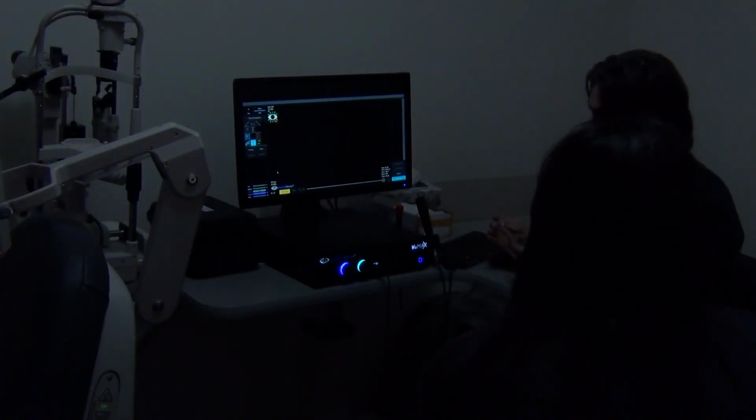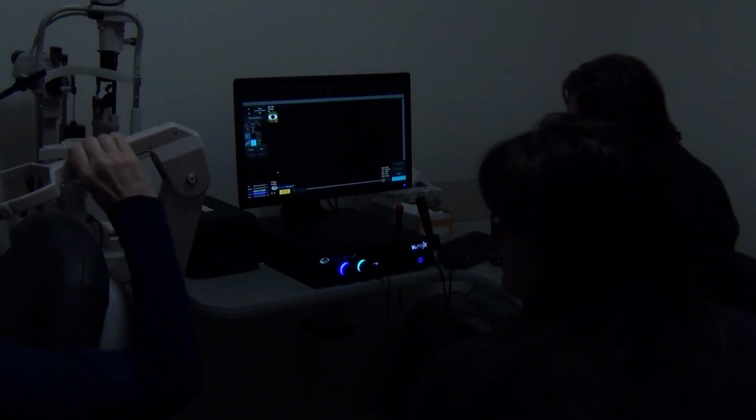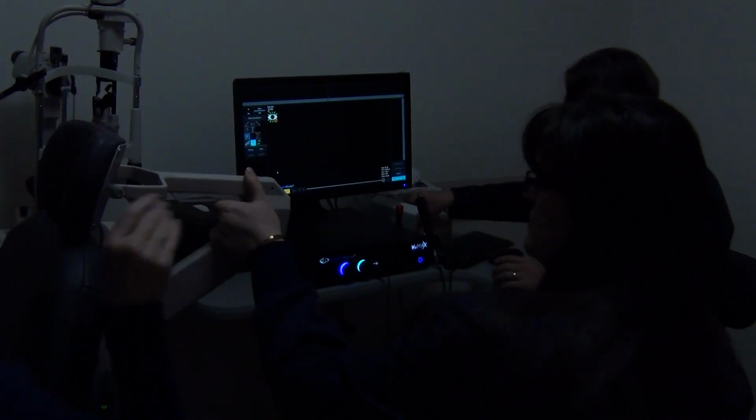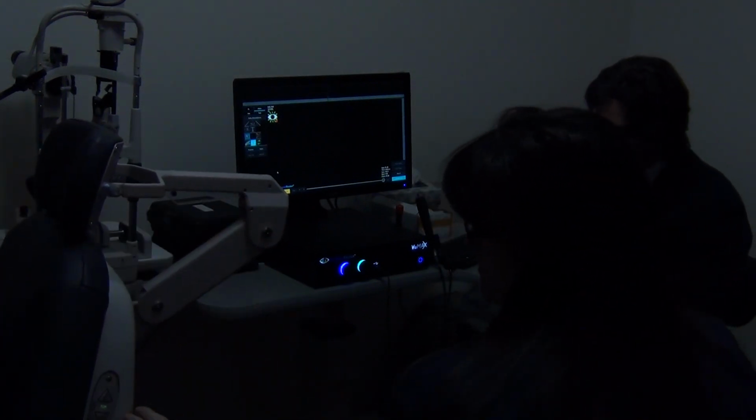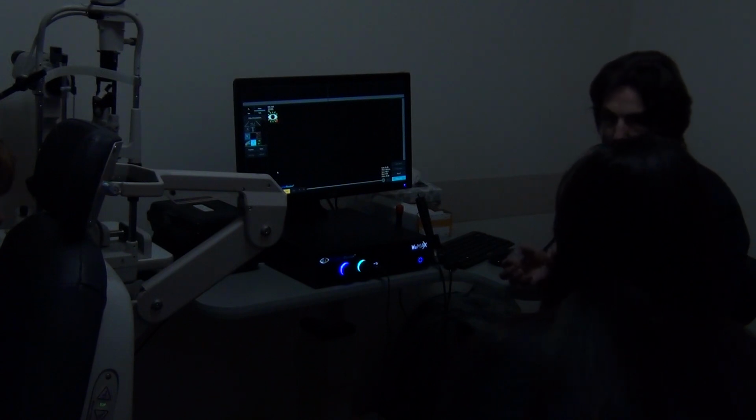I prefer 20 or 22 millimeter cups. Depends on the eyeball size. 20 is just fine. There's a soft shell cup. I personally prefer not to use it because if you accidentally squeeze it or patient has strong lids, they will push it out.